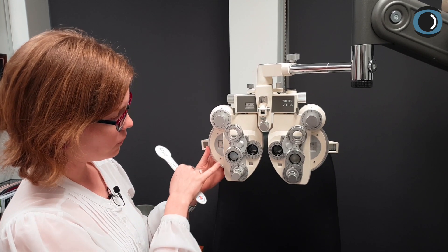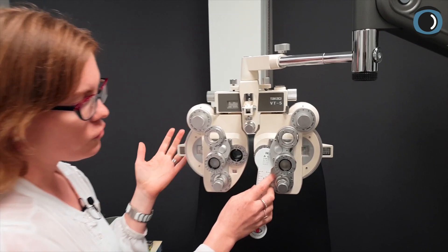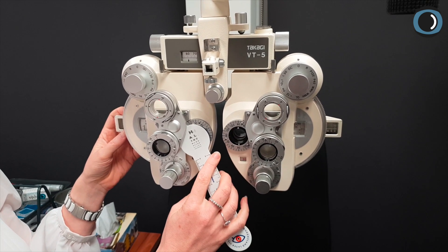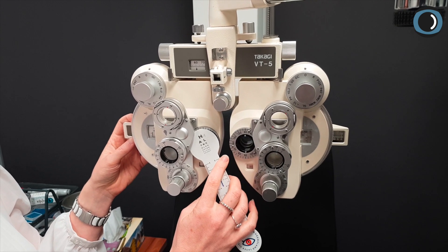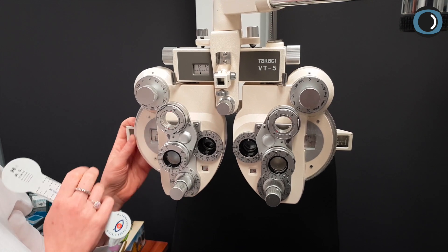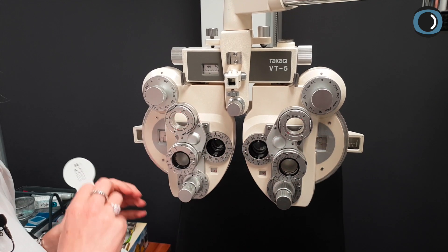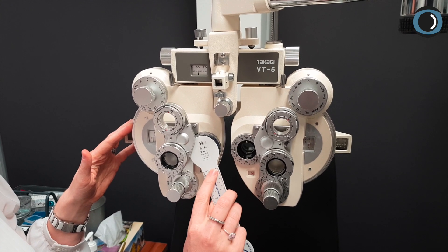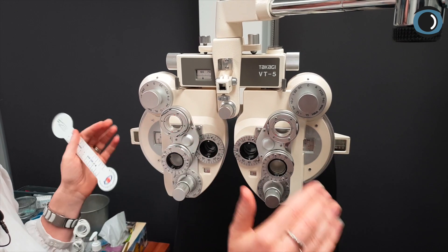First, we're going to put plus 0.25 in front of the right eye. With plus 0.25 in front of the right eye: which eye is clearer, Mr. Invisible Patient — your right eye or your left eye? Presumably they say their left eye. If that's the case, take out that plus 0.25 and let's see if adding plus 0.25 to the left eye makes them prefer their right eye. Which do you prefer — right or left? If they say right eye, take out the last plus 0.25 and the job's done.